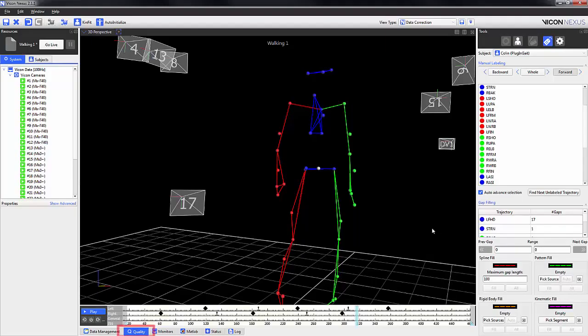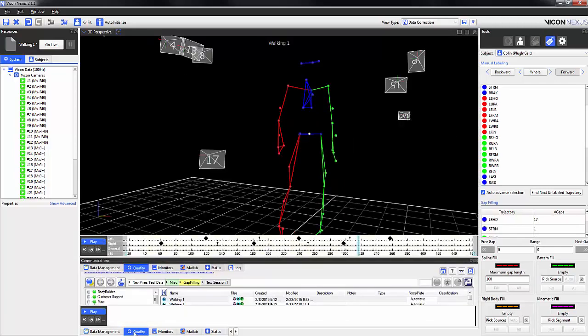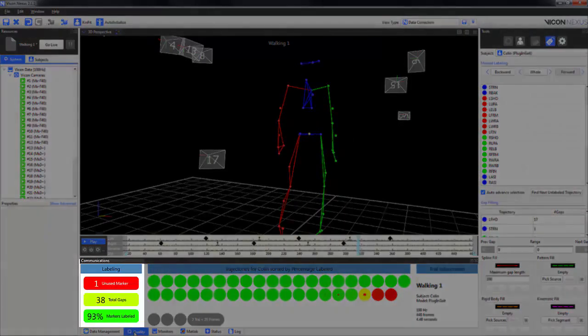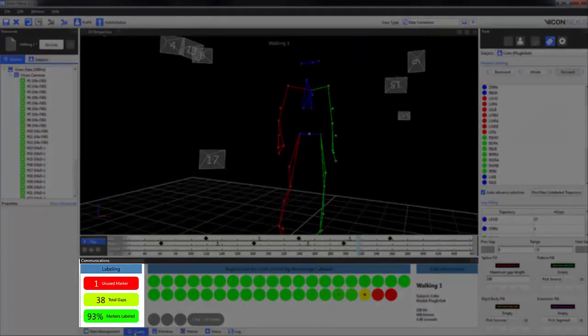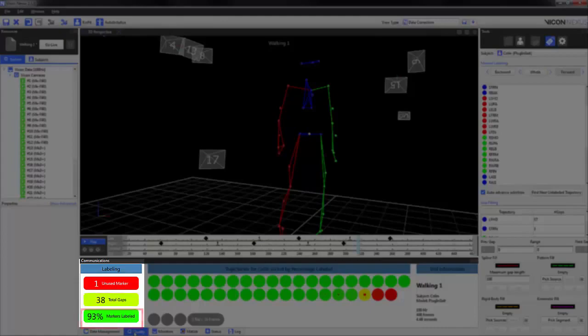What's new to Nexus 2 is the quality tab in the communications window. We can open and close this window by double clicking on the name. Under the labeling heading, we can see the amounts of unused markers, the number of gaps, and the percentage of markers that are labeled.